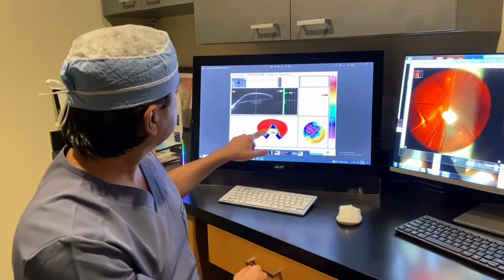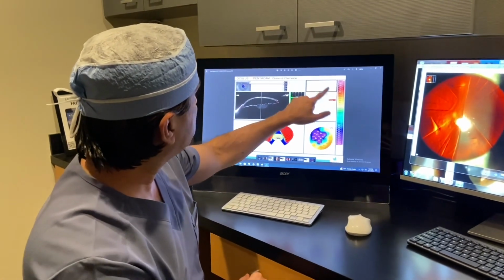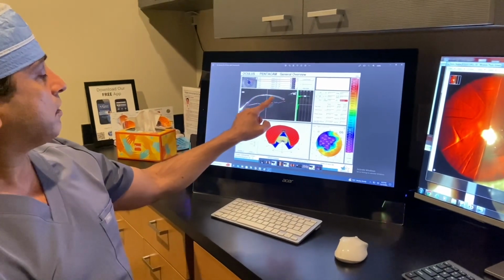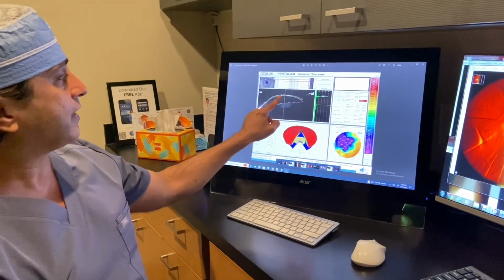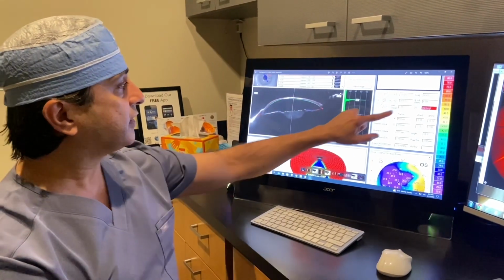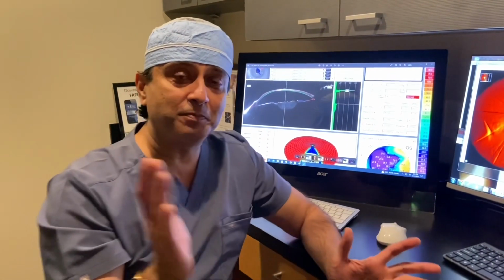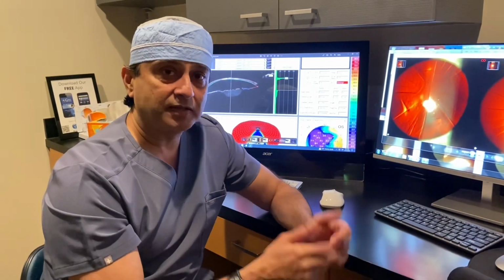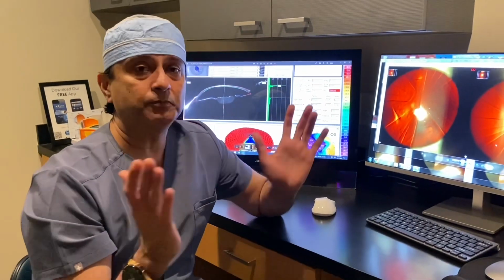Here's another patient, as you can see here. This patient has 6.6 diopters of astigmatism, but look at the cornea. Just 300 micron, extreme scarring from bad LASIK and RK, as you can see here. Look at this cornea. Nothing is measurable. In fact, none of my machines could measure a lens power. None of my Oculus Pentacam, A scans, all the technologies we have, none of them could measure anything.